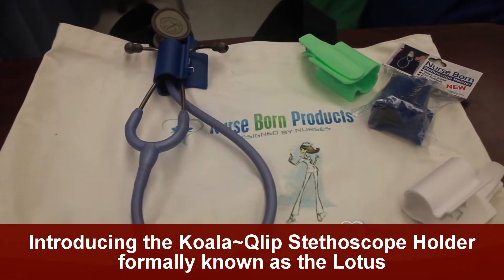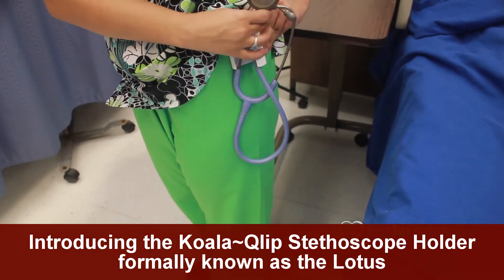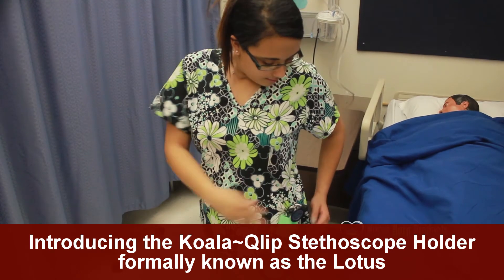The Lotus is the only stethoscope holder on the market that attaches anywhere onto your scrub pocket, waistband, or belt, and holds your stethoscope in a variety of configurations.